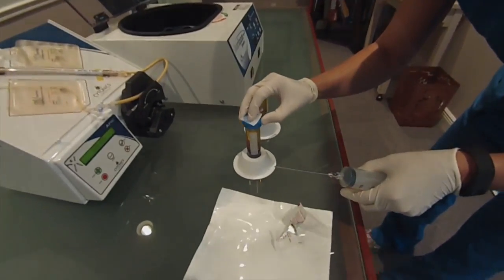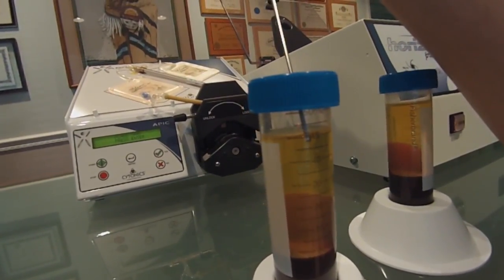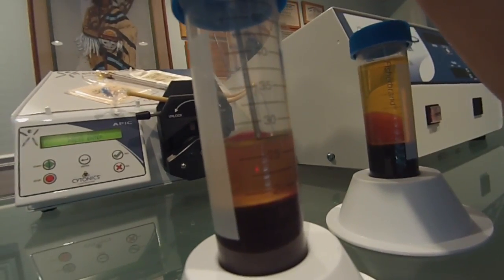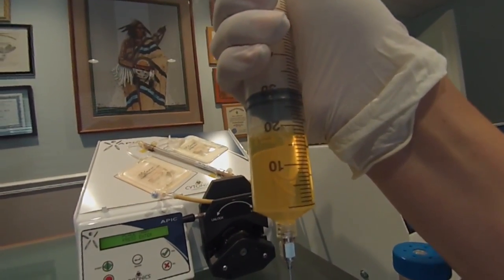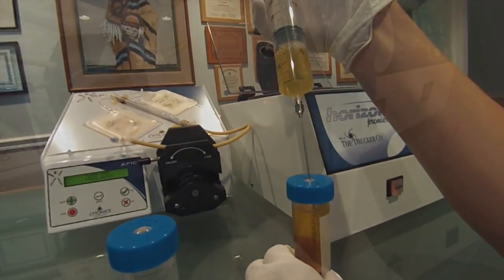Remove the sheath cap from the needle and discard. Alcohol wipe the septum of each centrifuge tube and carefully insert the plasma collection needle into the tube. Slowly collect plasma from the top down, collecting 15 to 20 cc's of plasma, being careful not to disturb the buffy coat. Ensure that the plasma collection needle is at least two graduations above the buffy coat at all times.